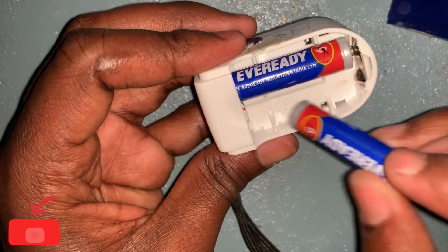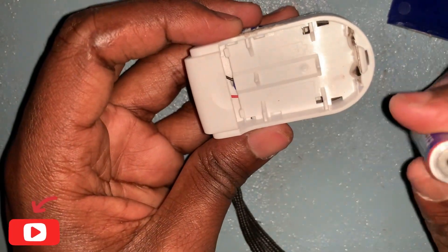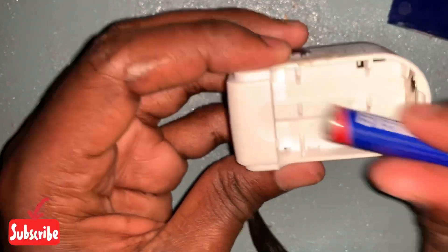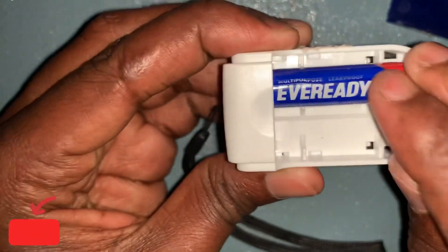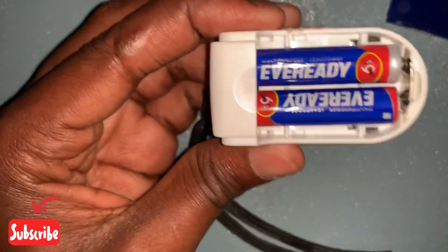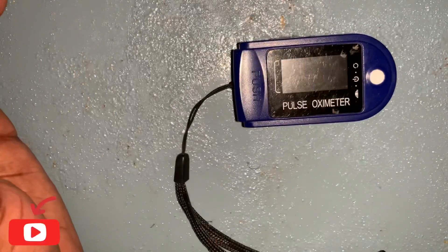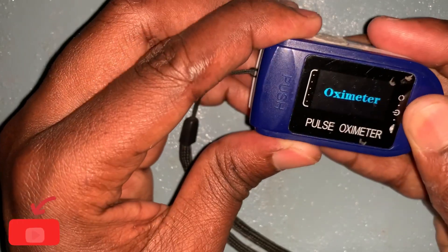As you can see, this is the battery orientation — this one indicates the head of the battery, and here is where the head of the battery goes. Now put the cover back on. We have now mounted the device completely back together. Let's switch it on.